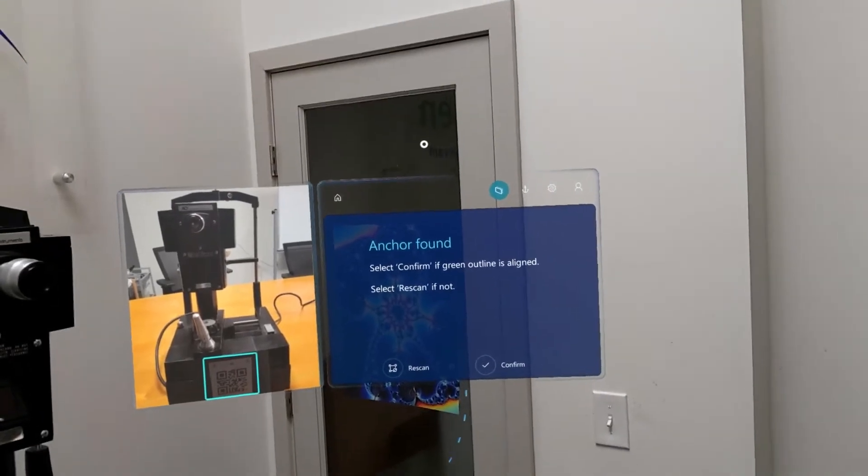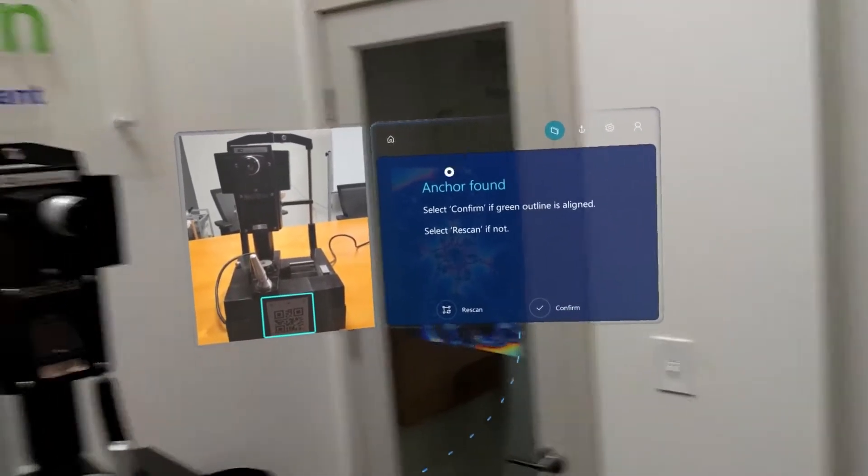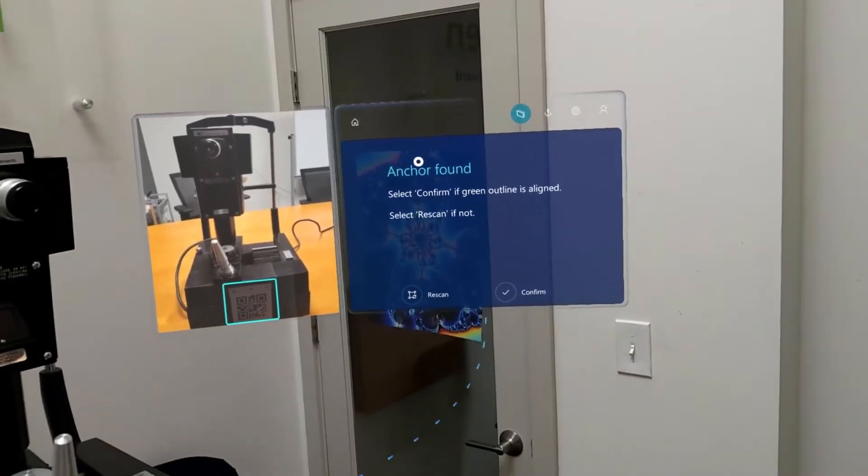Sphergen Technologies here from New Haven, Connecticut, to demonstrate a guide created for the Microsoft HoloLens 2 using the Guides program from the Dynamics 365 suite offered by Microsoft.